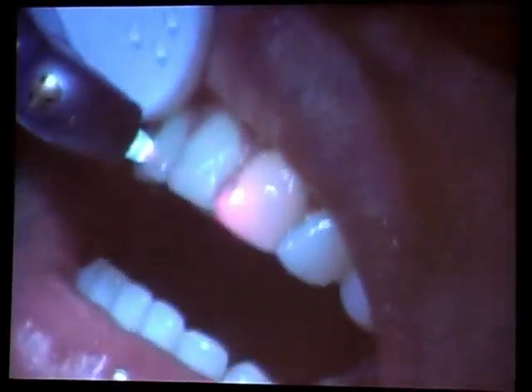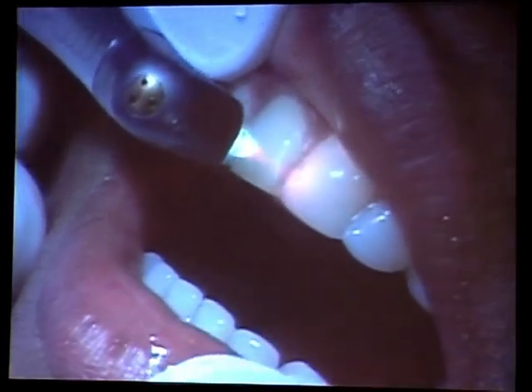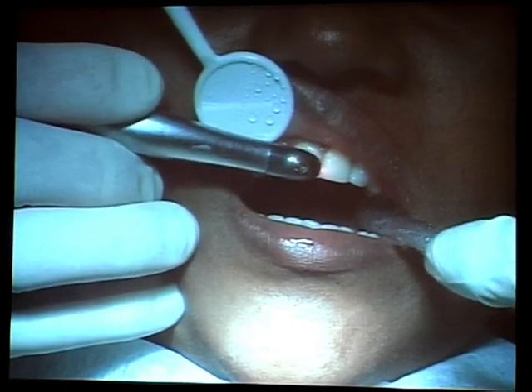This is done without anesthesia, remember. There is no anesthetic given. And you may see how the filling is gone away. Your hand is covering it. The suction hand? Is that better? Yeah, much better. So that angle was fine as well.